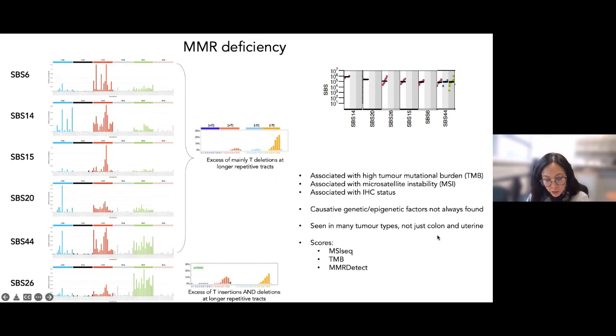And just like what I mentioned earlier, using other algorithms to reinforce your finding, you can use any of these additional algorithms that are out there. MSI-seq, TMB, MMR-detect, all of it helps you to have the conviction that what you're seeing is mismatch repair deficiency.